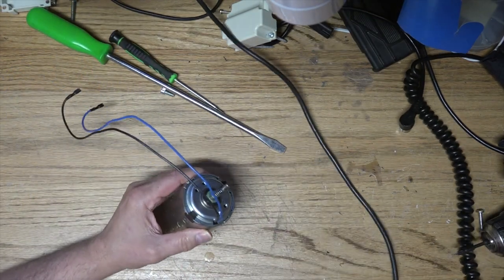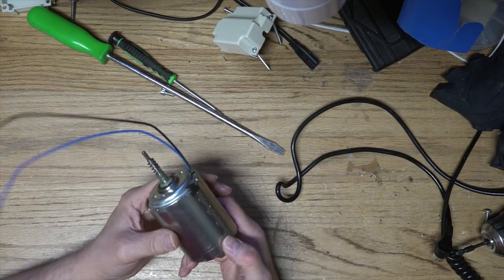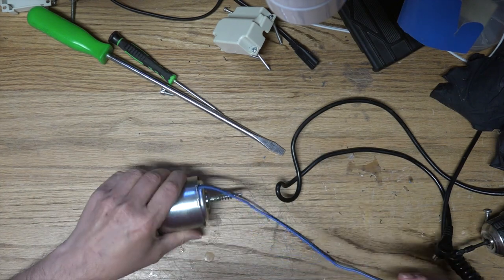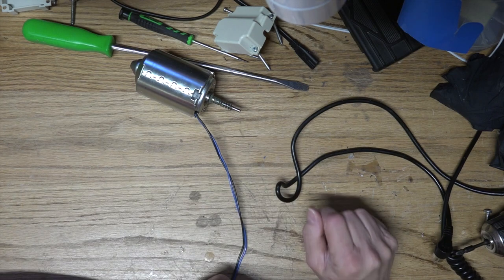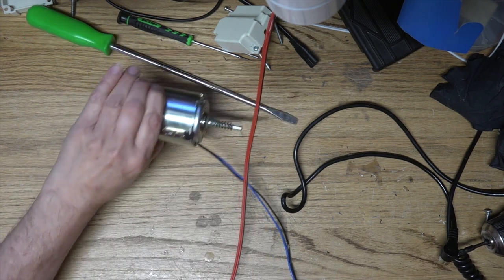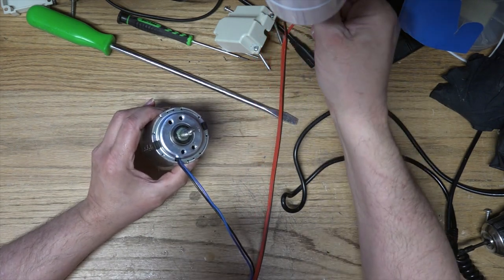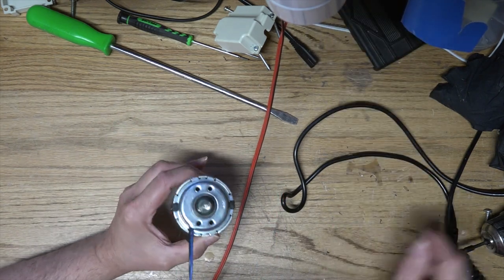Unfortunately, oh, it's got magnets. Unfortunately, it appears that there's no mounting flange. You'd have to clamp it into something to use it. But let's see what we can drive this with. I wonder if I can just drive it with 5 volts. Would that be possible? Let's put the black on the black, the black on the blue, and the red on the black. And that is set to, centered to 5 volts here. And push the button. Oh yeah, look at that.